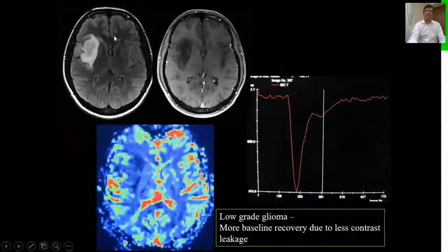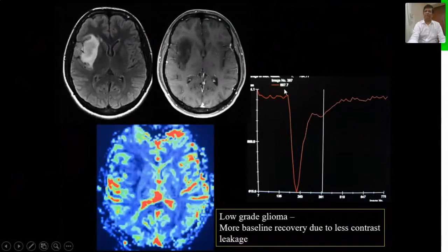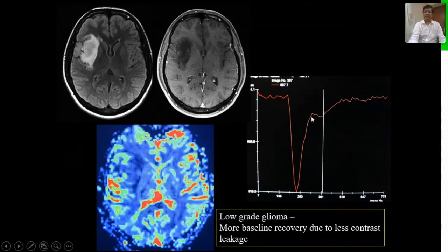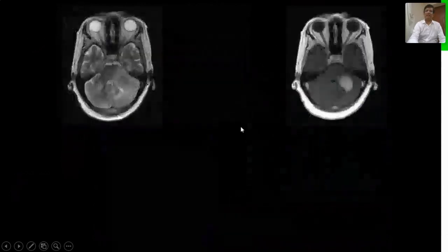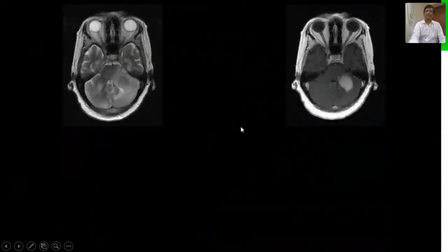Compare that with a low-grade glioma in the right periSylvian region. The pickup of contrast is not so steep and washout is almost 80–85%. So low-grade gliomas will have more washout, while high-grade gliomas will have less washout.